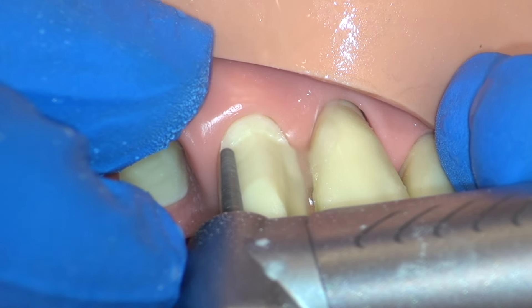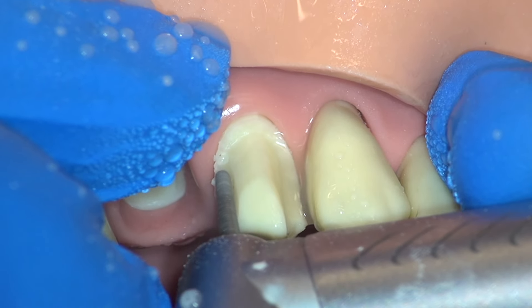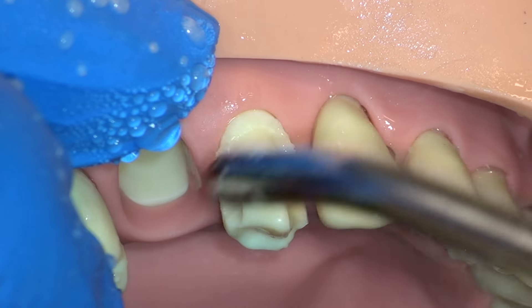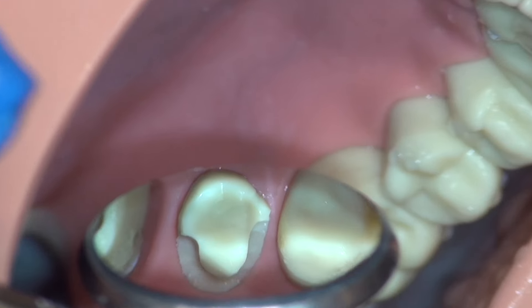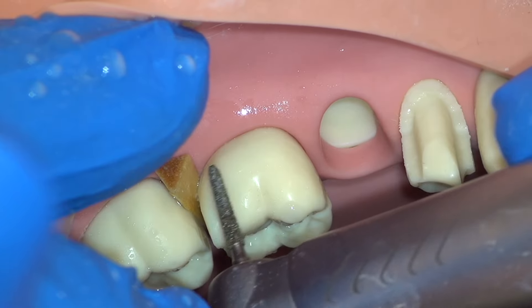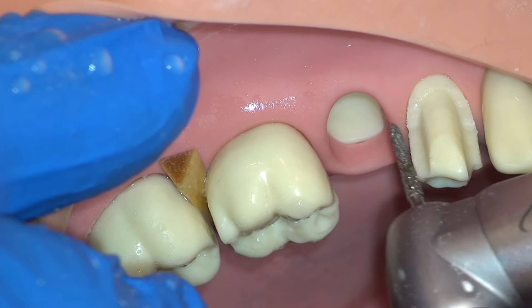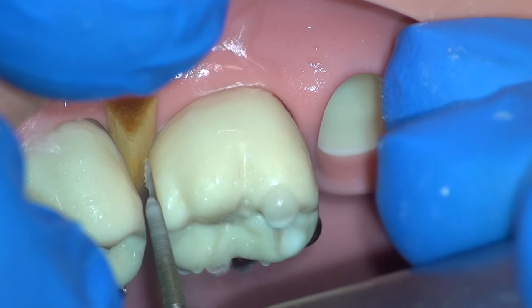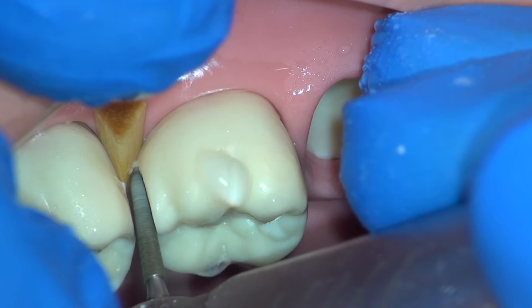Consider the direction of rotation of the burr — this should be changed so that the burr can either be moving with the direction you're cutting or against the direction you're cutting. Our initial preparation here is angled to the distal; we will fix this later. We have lots of room to correct the TOC. Moving now to our green chamfer burr, we will complete the rest of the axial preparation of both teeth with this burr. The reason I began with the mod shoulder in this case was to minimize the number of burr changes. Work carefully and smoothly to not hit the adjacent tooth.